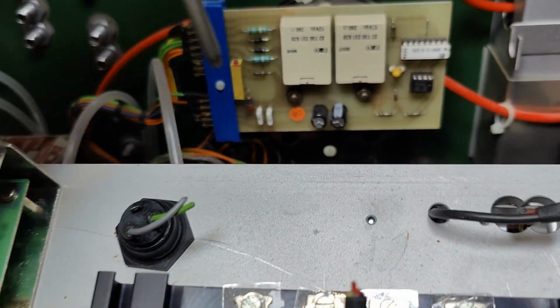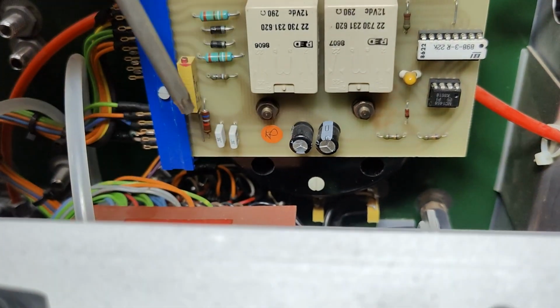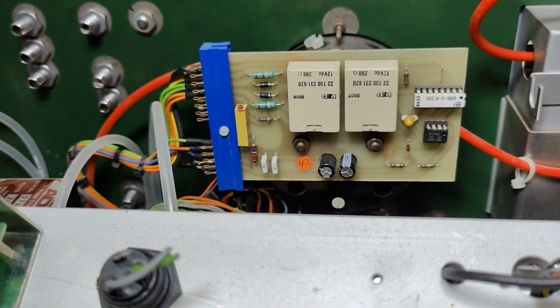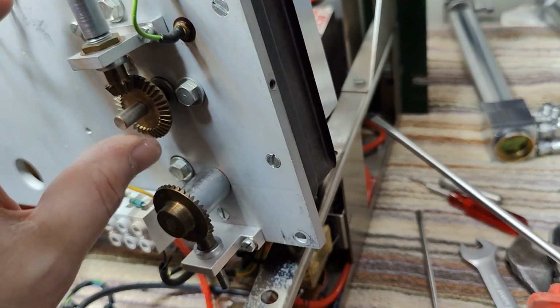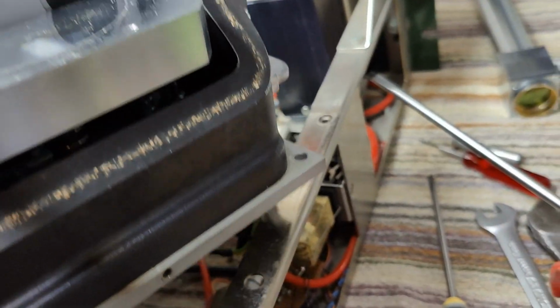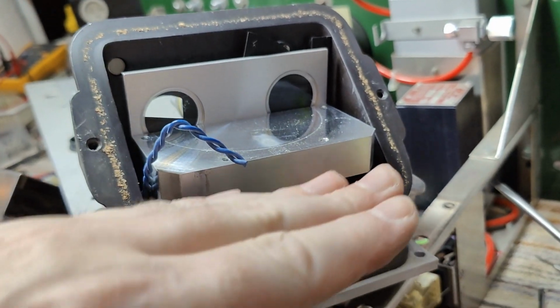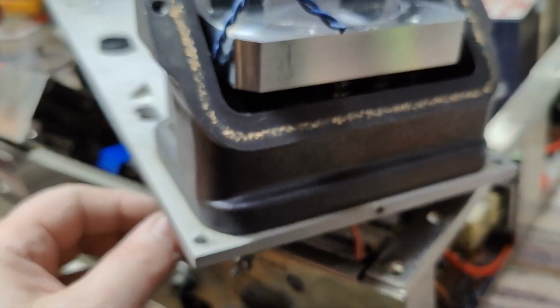Here at the front meter readout, we got some relays and again some scaling resistors and a little op amp, and not a lot of fancy to say about that really. So I think I figured this out. The mechanical adjustments here, what they do is they move this one up and down and it tilts. So the other one is the tilt and that one is the up and down.